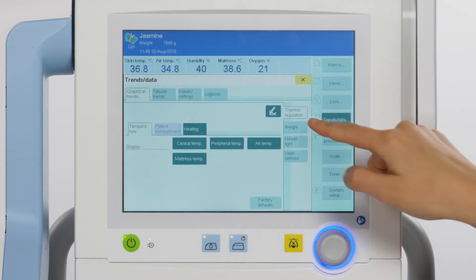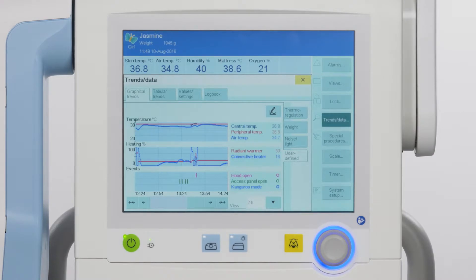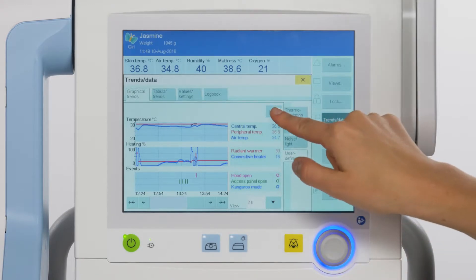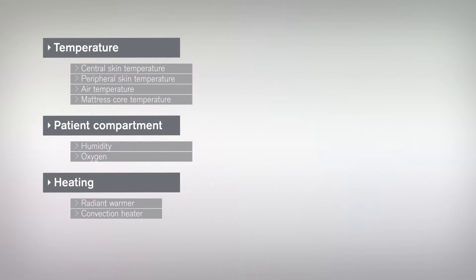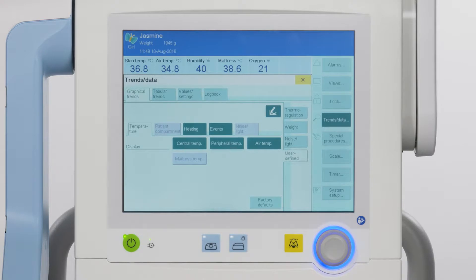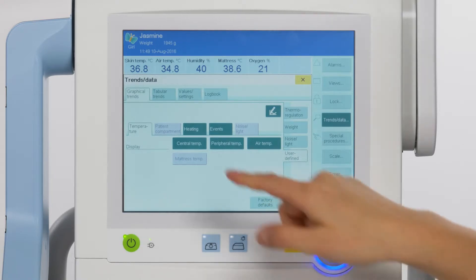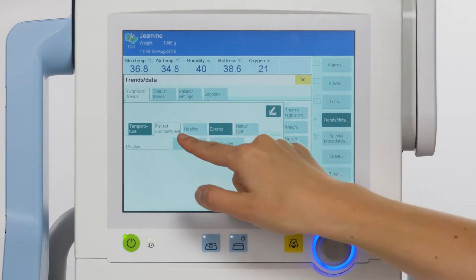Here are some vertical tabs and their uses. Using the vertical tab weight, the measured patient weight is displayed, and one measured value is saved per day. Using the vertical tab user defined, users can decide which trends to display from the available overviews and parameters. Note that a maximum of three overviews can be displayed at the same time. If you wish to select a new parameter, you must deselect one of the other three. The colours of the buttons correspond to those of the indicators in the thermoregulation tab.